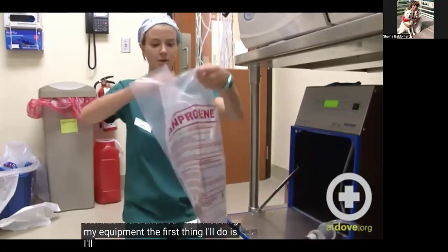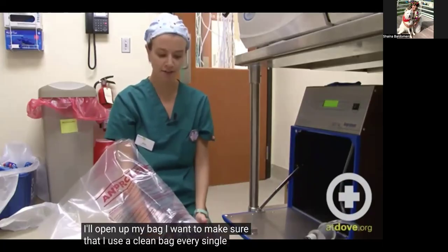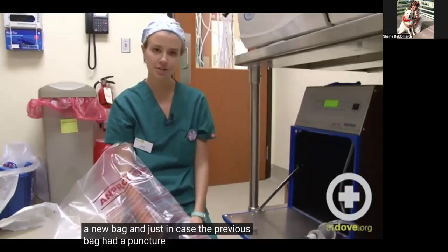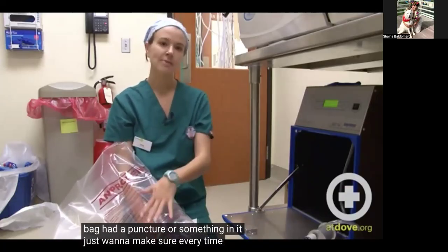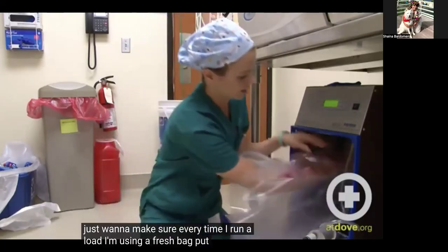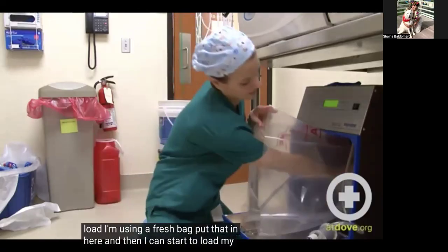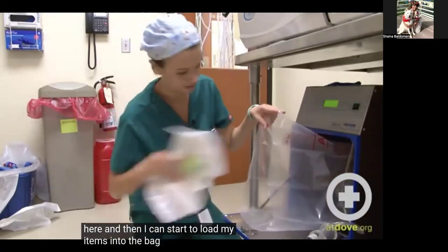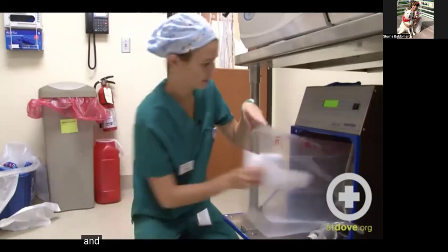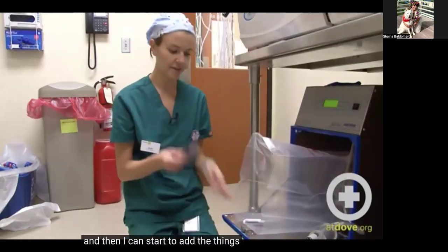The first thing I'll do is I'll open up my bag. I want to make sure that I use a clean bag every single time, a new bag, just in case the previous bag had a puncture or something in it. I just want to make sure every time I run a load, I'm using a fresh bag. So I'll put that in here, and then I can start to load my items into the bag. And then I can start to add the things that I need.